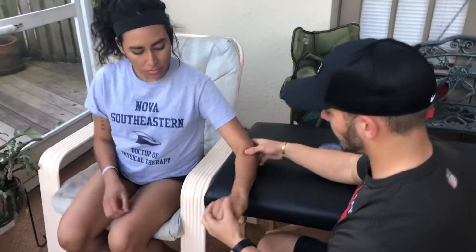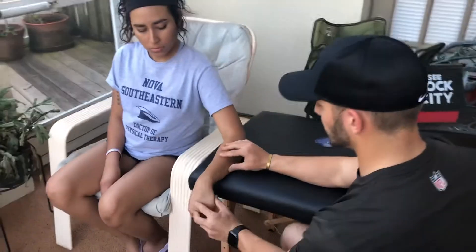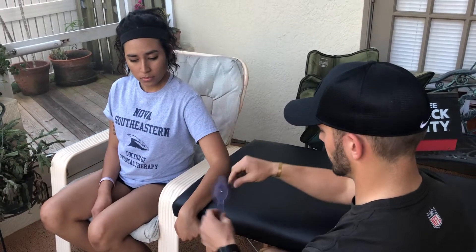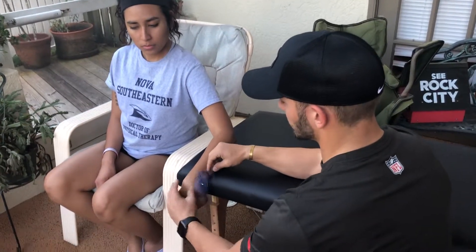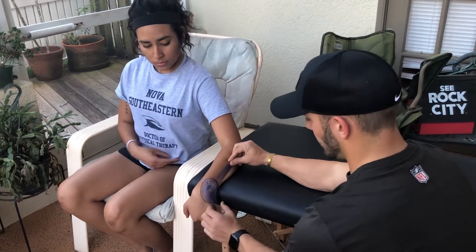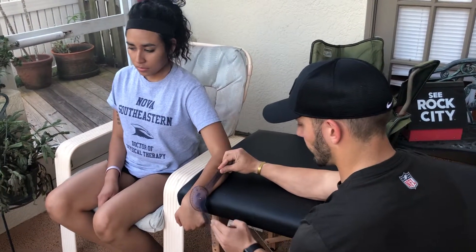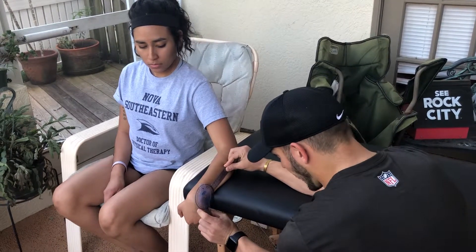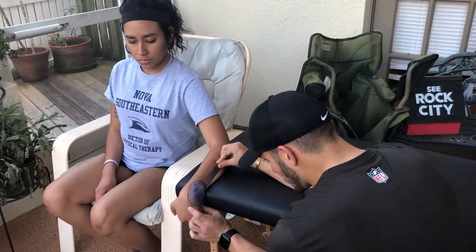Next, I will do flexion and extension of the wrist. Flexion is going to be down like that — have you do that for me, please. Good, you can relax your fingers. The axis of rotation is the triquetrum. The stationary arm is going to point towards the lateral epicondyle, and the moving arm is going to follow the lateral border of the fifth metacarpal. And I have 71 degrees. AOS norm for this is 80, so just a little less.